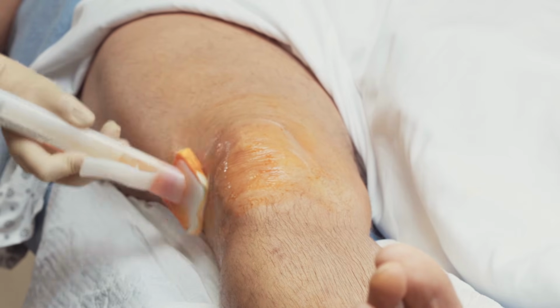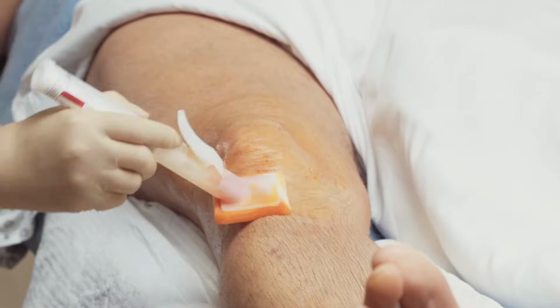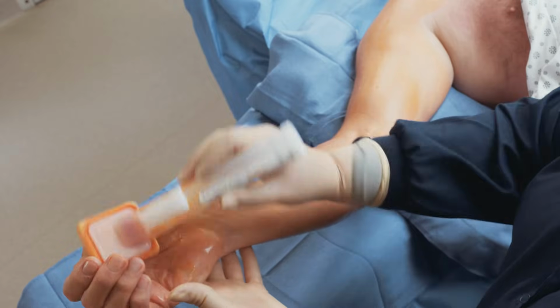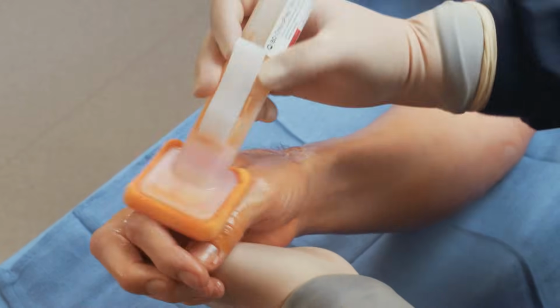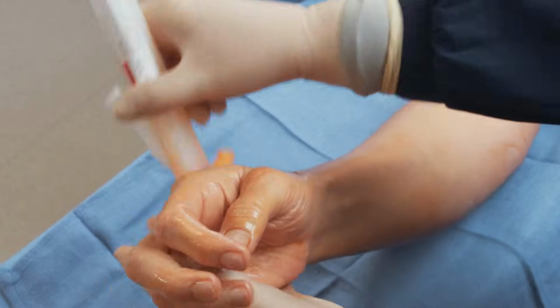If multiple insertion or incisional areas are indicated within the surgical treatment plan, each area must be treated equally for the recommended prep time. It may be necessary to use multiple applicators depending on the surgical areas. If multiple applicators are used, it is not necessary to start at the insertion or incisional area if you have completed the appropriate prep time for that section.